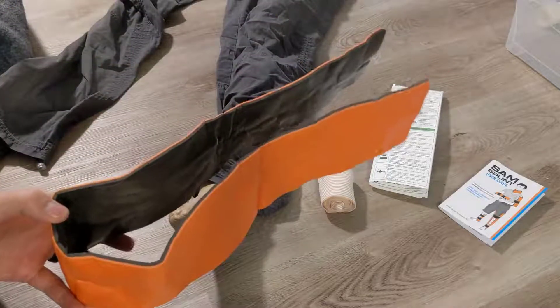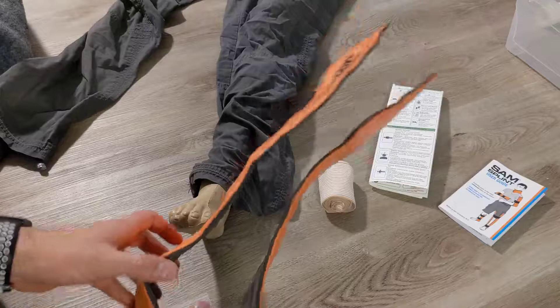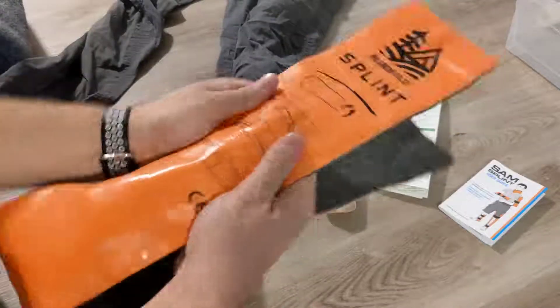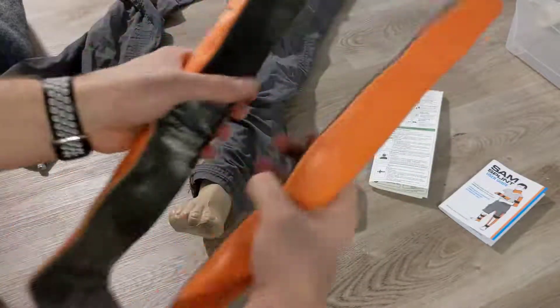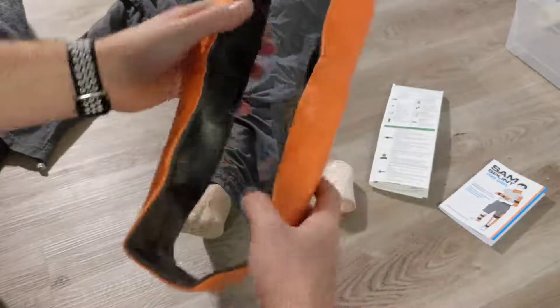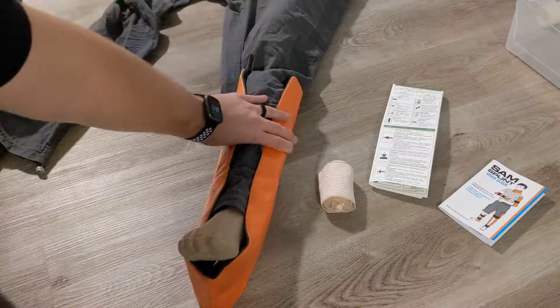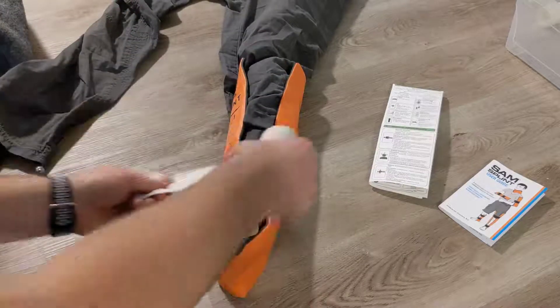What I really like using is moldable aluminum splints, and we can do this very similar to how we did a forearm injury. Splitting the splint in half like a U, then bending the splint in towards the middle to create a nice concave shape. Now we have our two C's facing the middle — you can wrap this around the leg and hold it in so it's nice and secure, then use an elastic wrap to finish securing it.